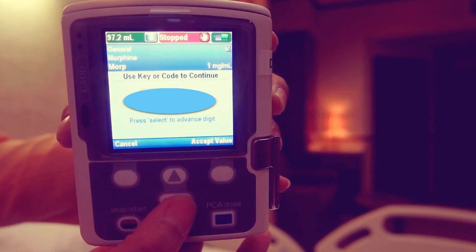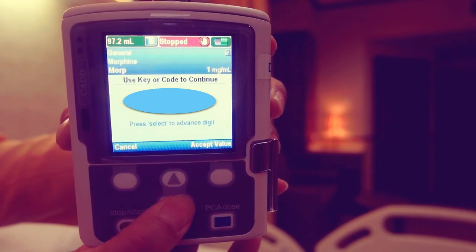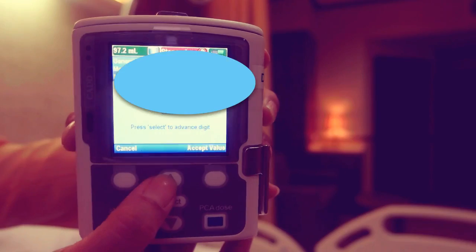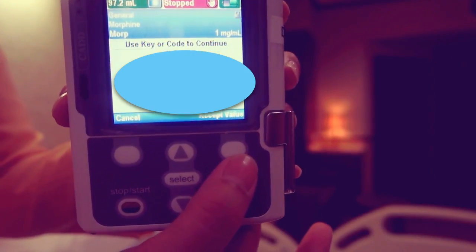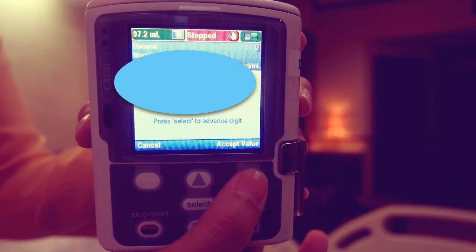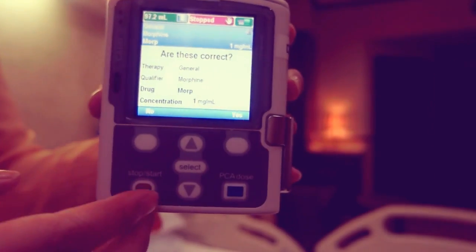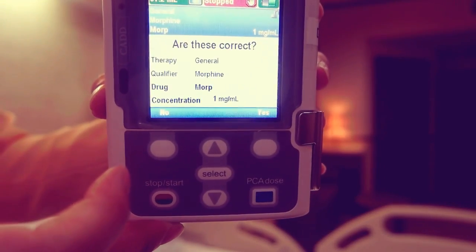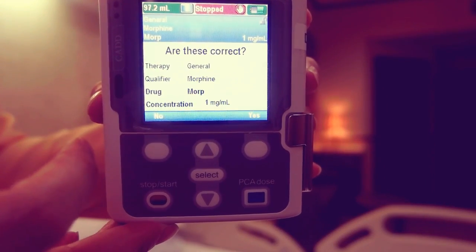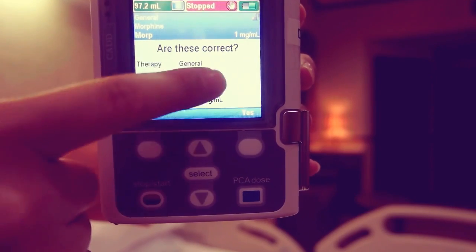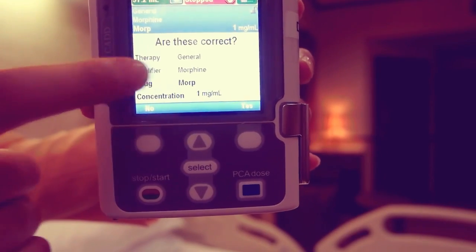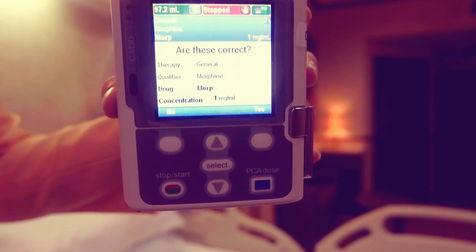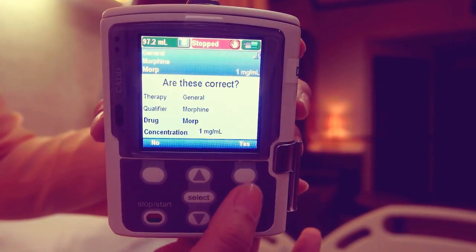Unlock the keypad using the security code. Then press accept value. Confirm that you have selected the correct therapy, qualifier, drug and concentration. Verify and press yes.